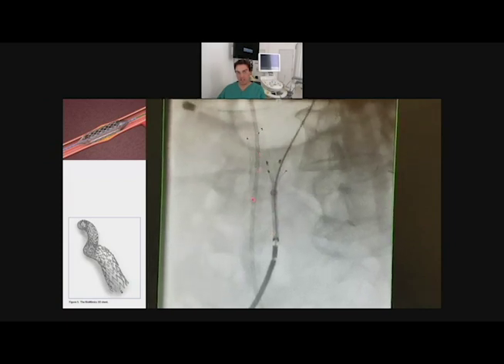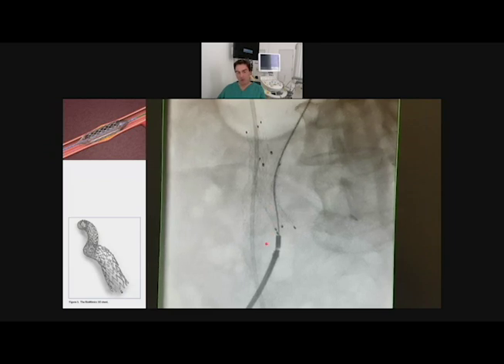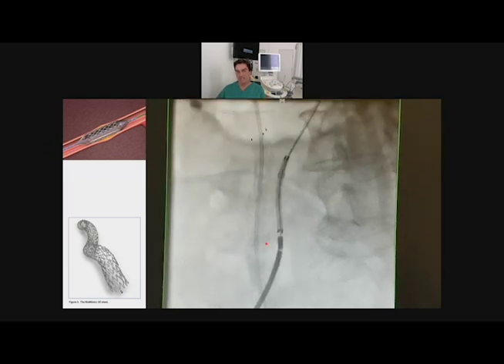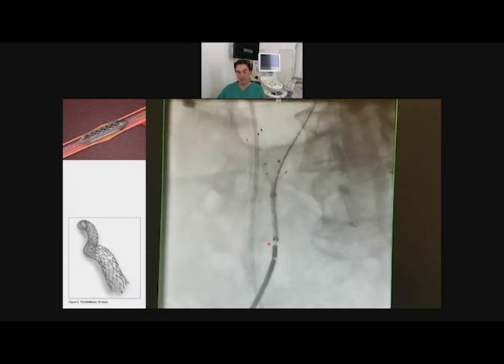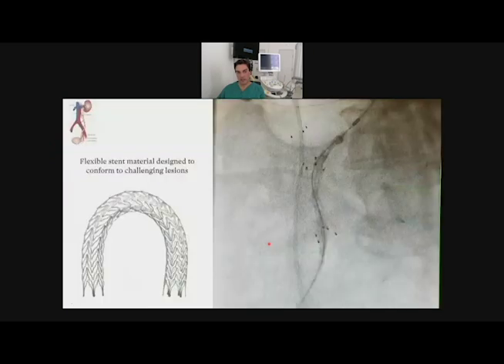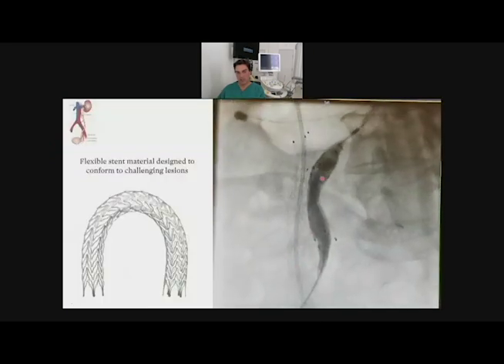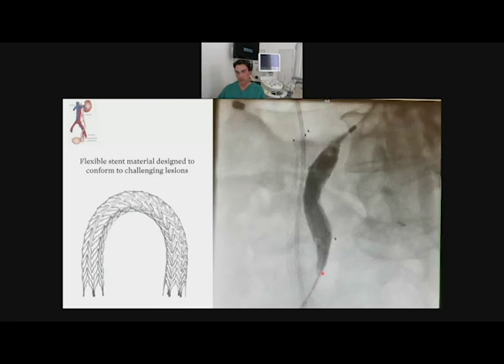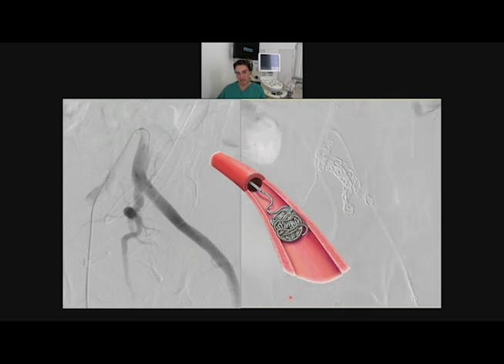But our stent was working very well before because it's normal urine without any hematuria, and both sides are now closed, and you don't need any more treatment, only to put two stents on both sides if you have a ureteral arterial fistula. Simple to see, they check it also. This is from the arterial side. All is closed nicely, and this is the idea.